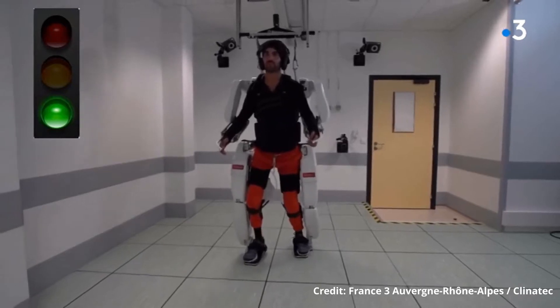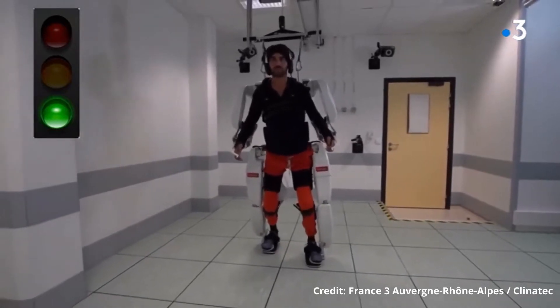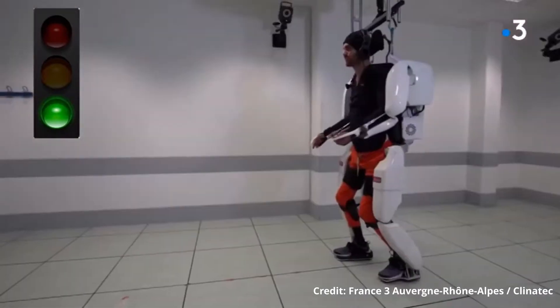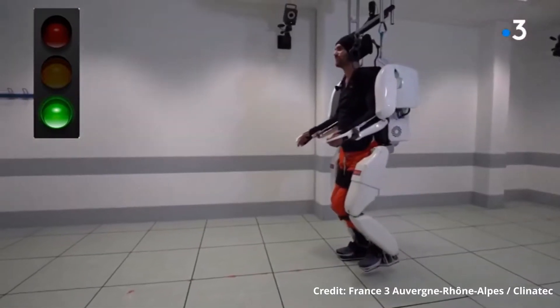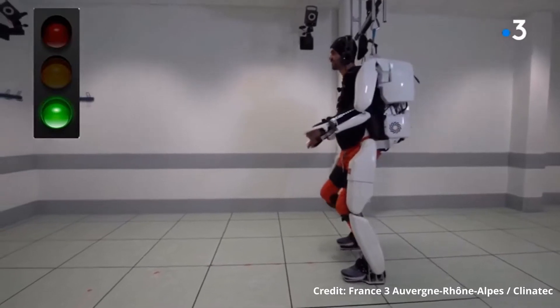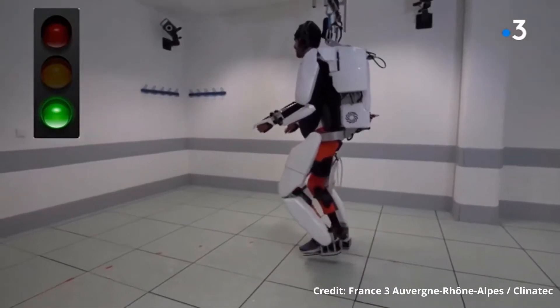This man is quadriplegic — he cannot move his legs or arms — and yet he is controlling a full exoskeleton, all four limbs, with his own mind. Amazing, right? But what are the challenges in making paralyzed people move again? Hey everybody, welcome back to another video from The Dairy Monkey.